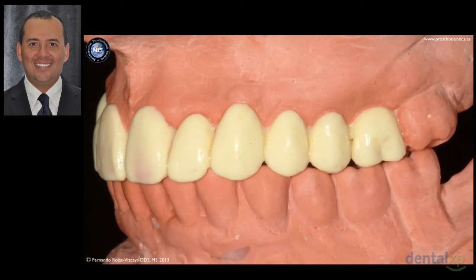Once you make or determine the 3D position of your teeth, I skip all the process about how I can know that this is the position. Remember that this is the topic for a different presentation. I just want to explain what is the 3A 2B rule and how we can apply it in a simple or complex case. My first step here was to determine what is the incisal edge of the maxillary central incisor, what is the tip of the canine and the full occlusal plane.